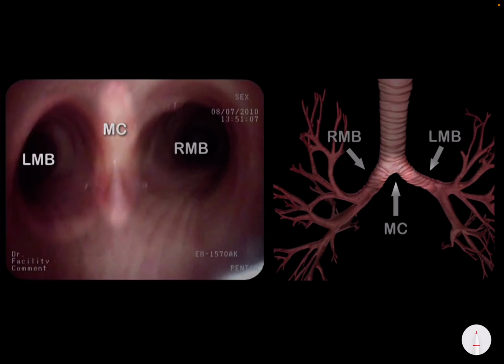It is decided by the CT scan or any other radiographic investigation. The structure which is normal is examined first, and then we enter the infected or pathological side. So if in the CT scan the consolidation is seen on the right side, then we go inside the left side first and then enter the right side later on.